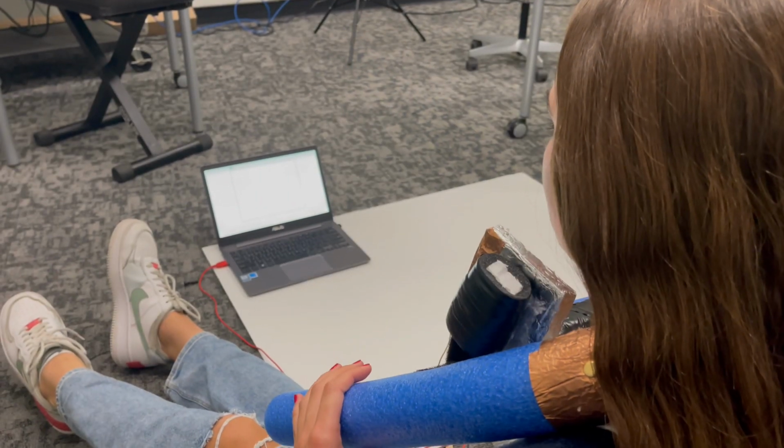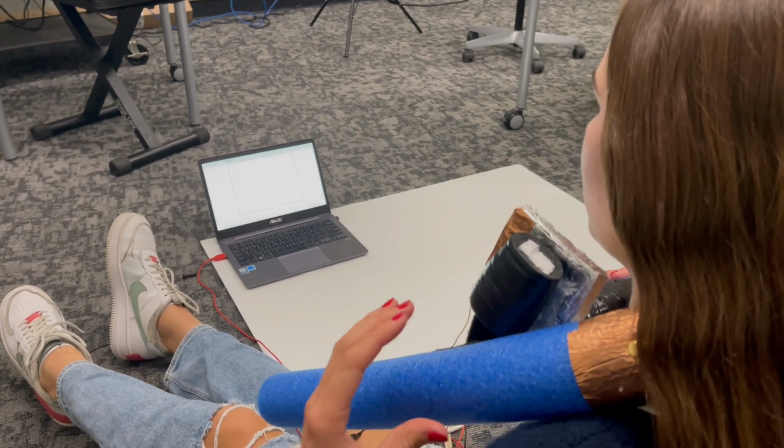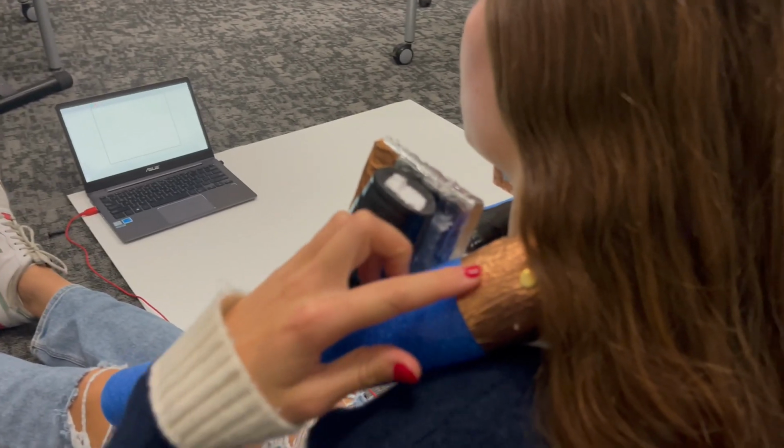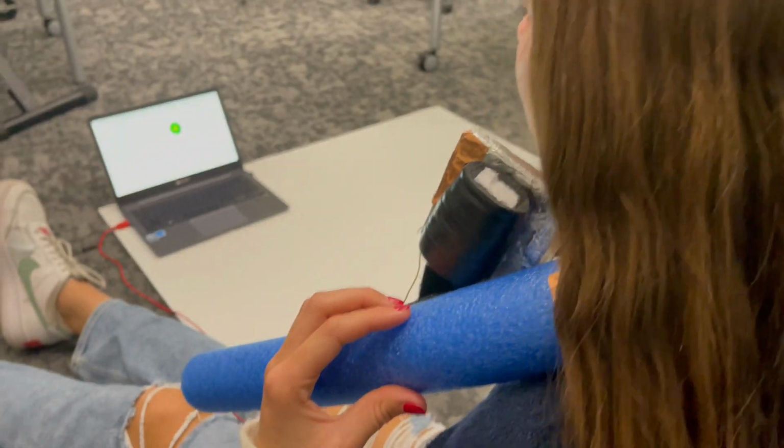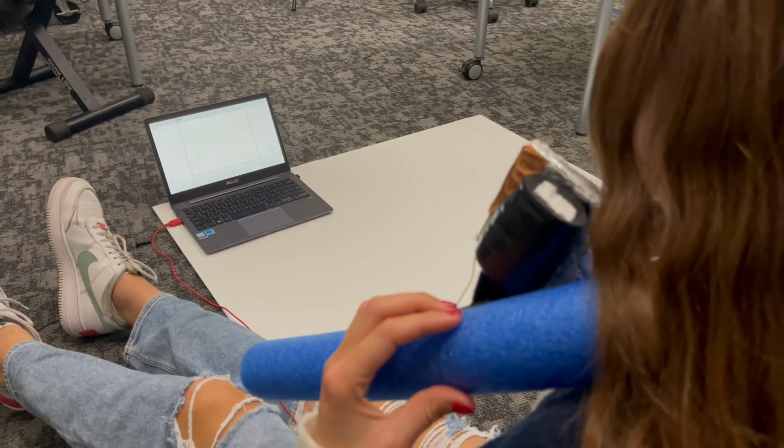So once you have the Quadriplegia neck add-on on, you will make sure that your neck is connected to the copper tape right there, because that's the ground. And then when you move left, that'll be left click, and right is space.